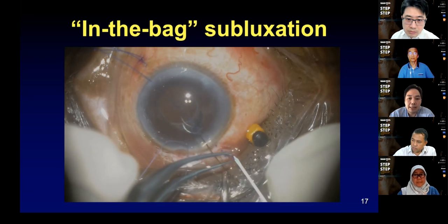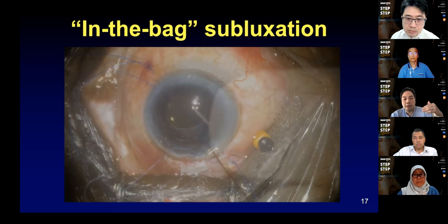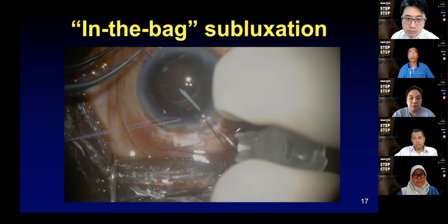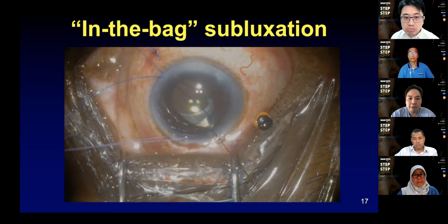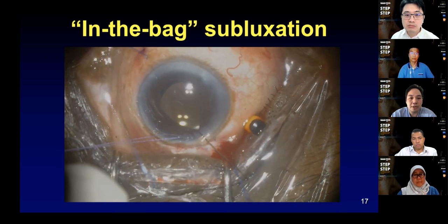I would tend to do it on both sides, unless you only have a significant subluxation on one side. But in this case, the whole lens was sitting posteriorly, so I needed to fixate both haptics to ensure that it comes back securely into the center. As you pull it through, this is probably the relatively more straightforward part.